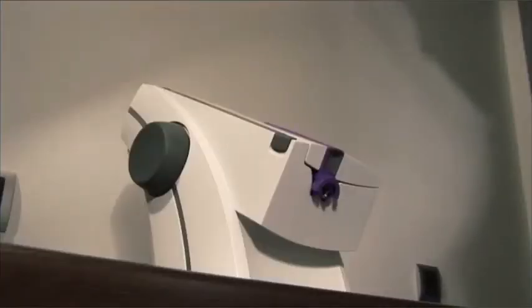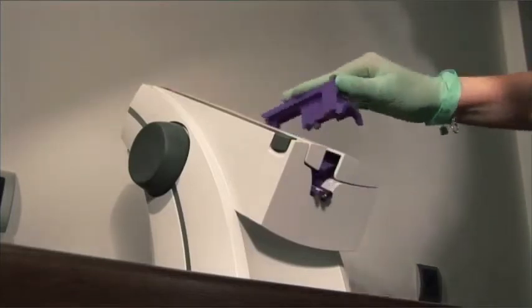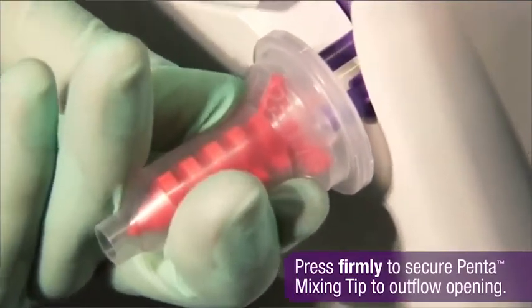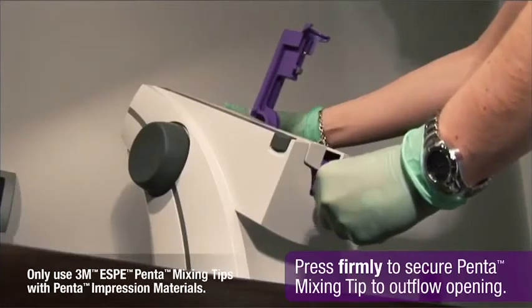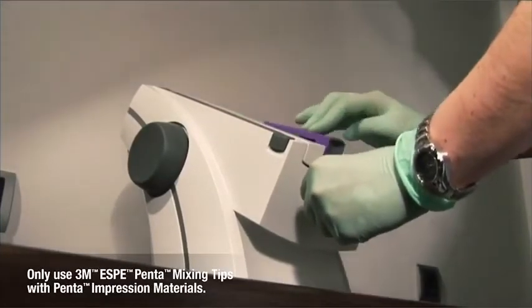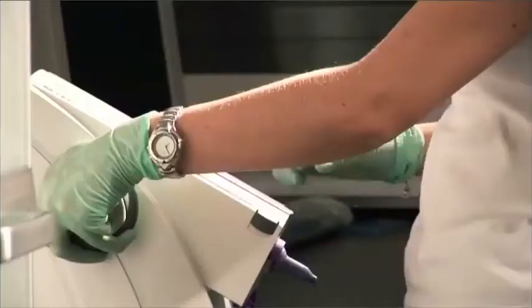First, lift the locking lever. It snaps into place in its uppermost position to make handling much easier. Then place a mixing tip on the mixing shaft, and turn it slightly to align the opening of the tip with the outflow opening on the cartridge. Then pull the locking lever down until you hear it click in place. And that's it.